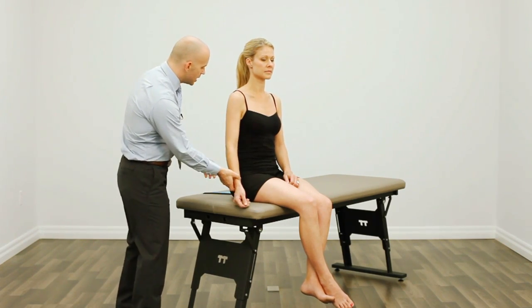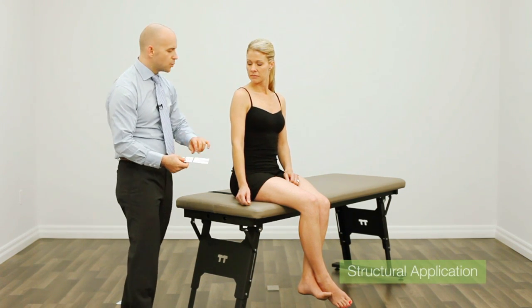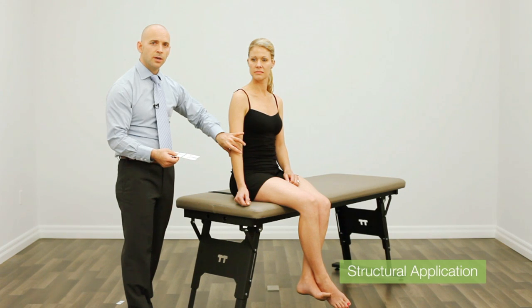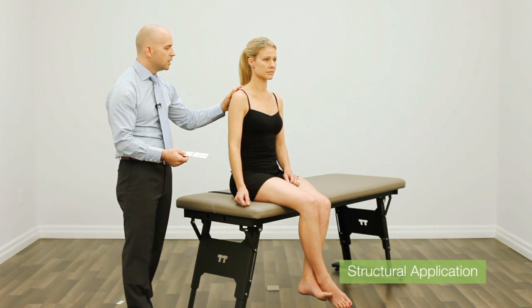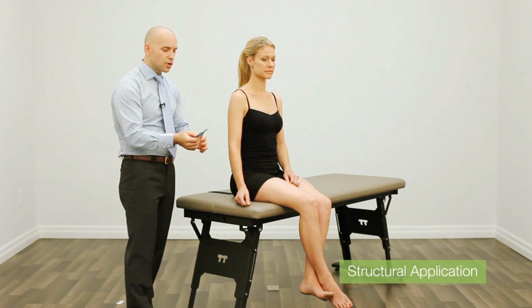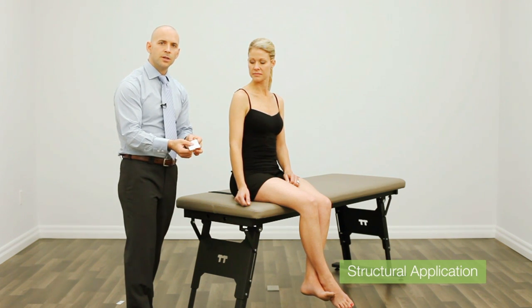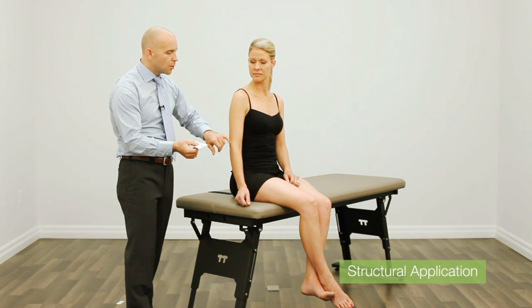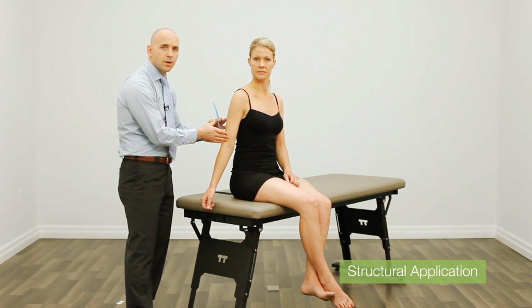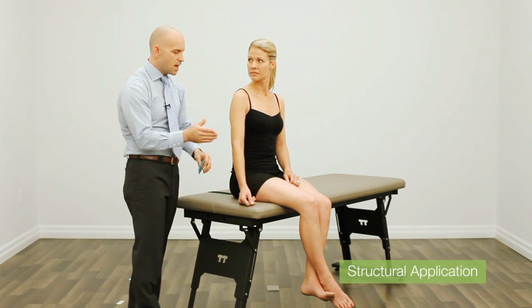Now I will demonstrate a structural application. A structural application is where I want to prevent potentially harmful ranges of motion from occurring anywhere within the body, and I want to improve positions or postures. The technique for a structural application is opposite to the neurosensory application. With a neurosensory application I stretched the tissue and not the tape; for a structural application, we're going to be stretching the tape and not the tissue.